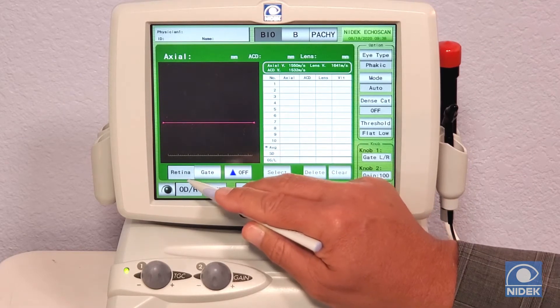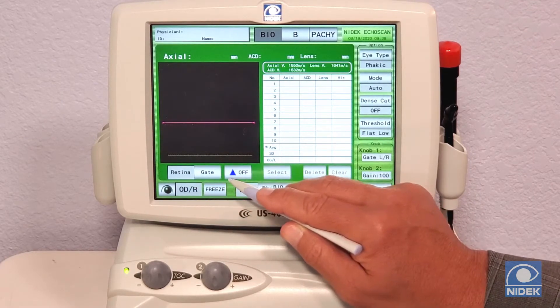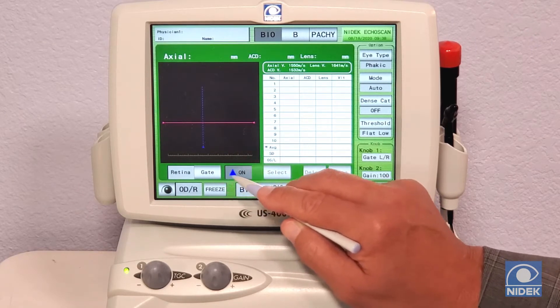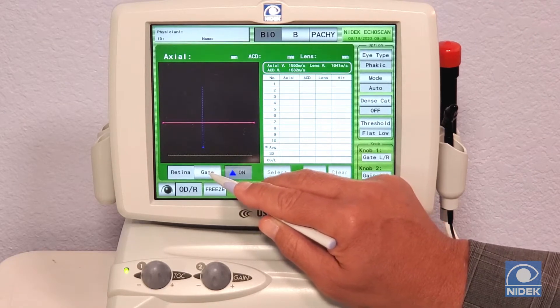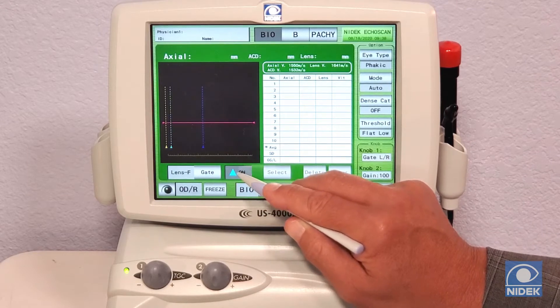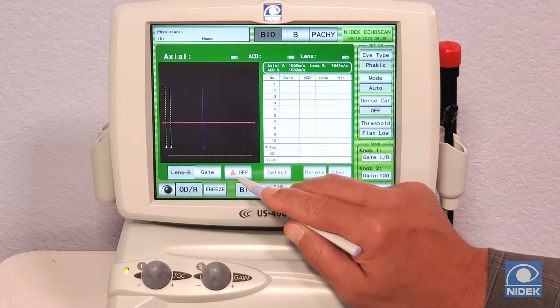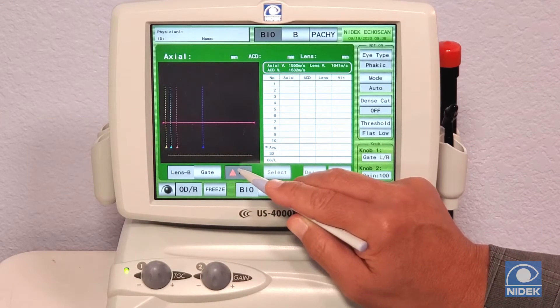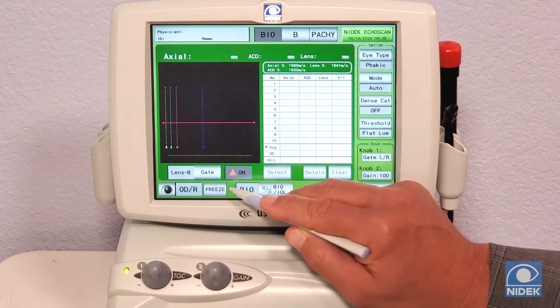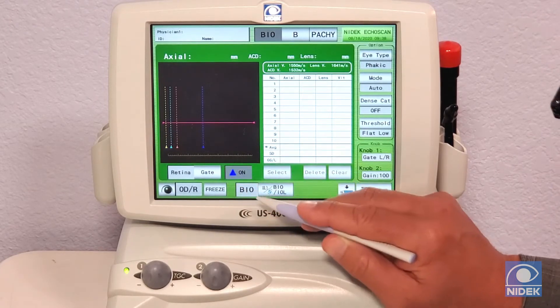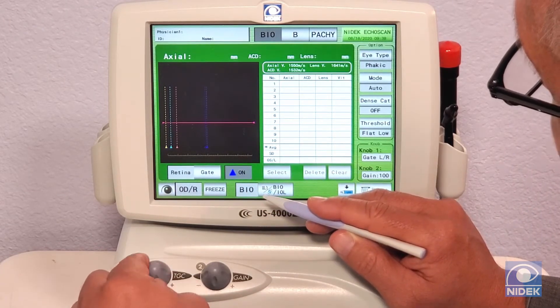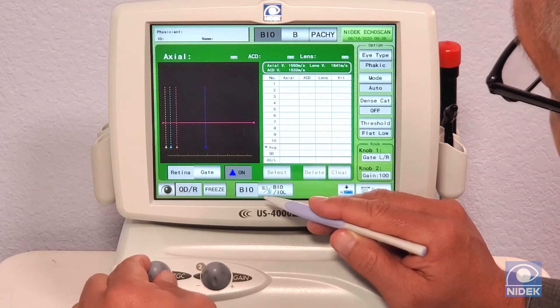These are your gates. We have automatic gates, but if you would like to turn your gates on manually, you can set the retina, cornea, front of lens, and back of lens gates. These gates can be individually moved by turning the time gain gate control.